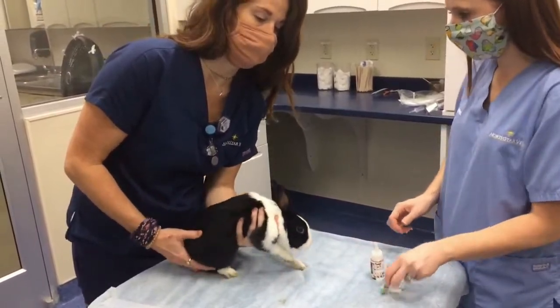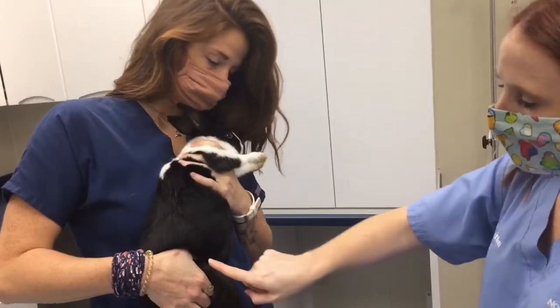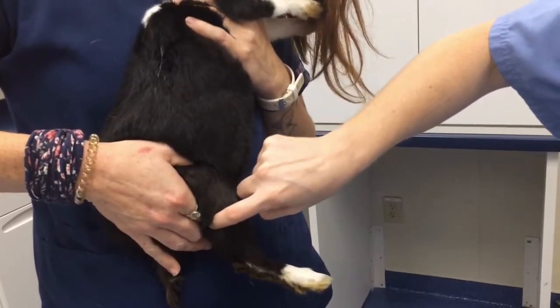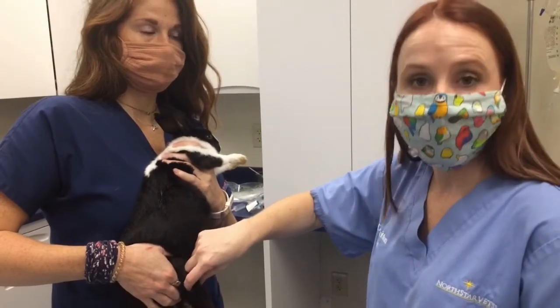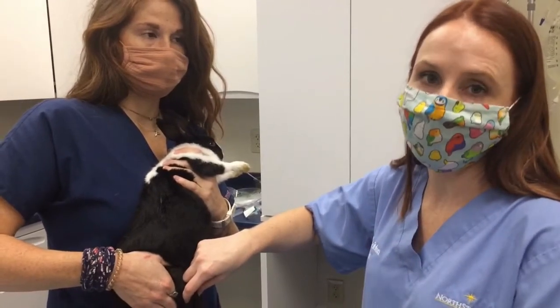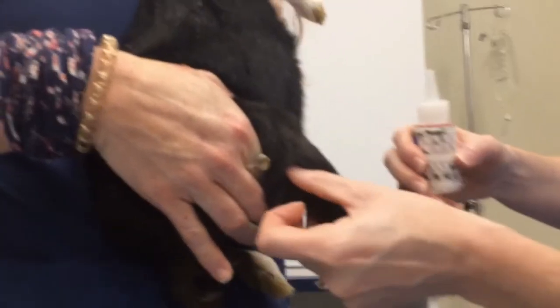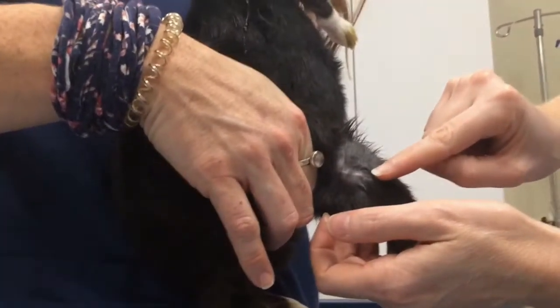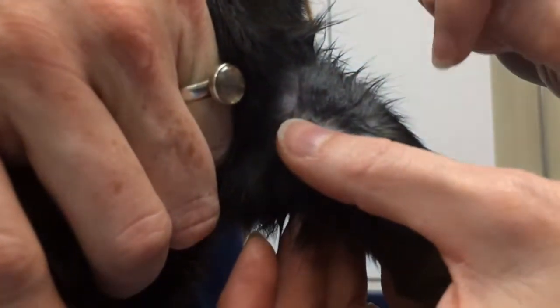Kate is going to hold Moo in the position described earlier — supported against her body, holding above the knee and supporting the front end. When finding the vessel, I strongly recommend feeling for it before putting alcohol on it. When you're feeling for the vessel without alcohol, it's usually really easy to feel. If you put alcohol there, sometimes fur clumped in the alcohol can feel like a vessel. It is more caudal than you expect. I can feel that vessel right here, so I'm just going to put some alcohol there and then separate the fur — and you can see that vessel right there. It does split as you go down, but this is the area I like to do the blood draw with.